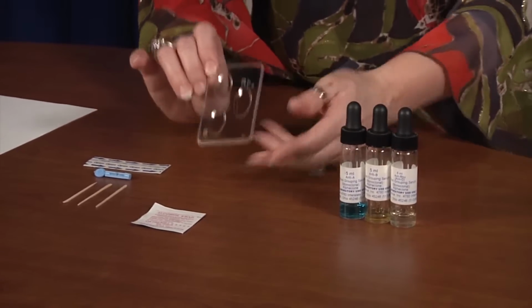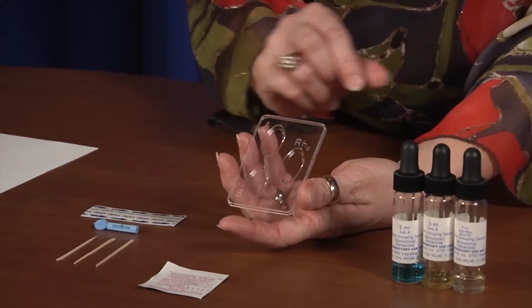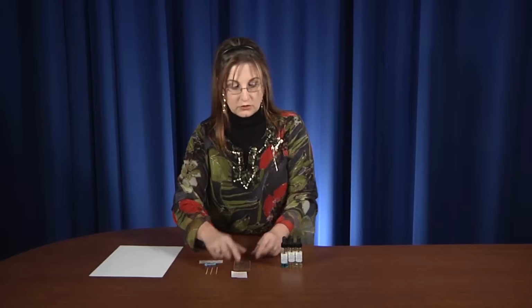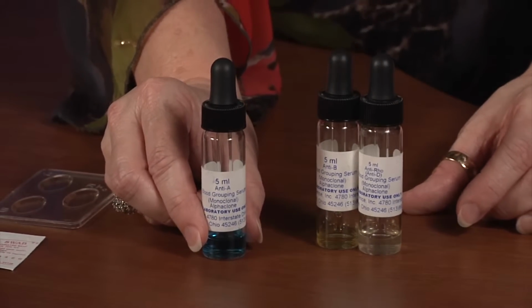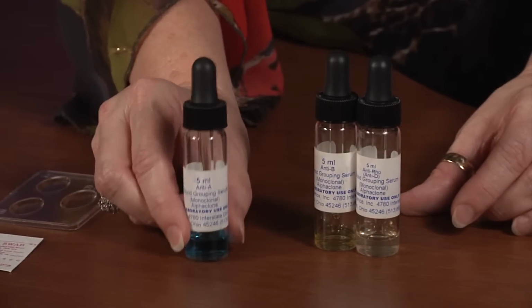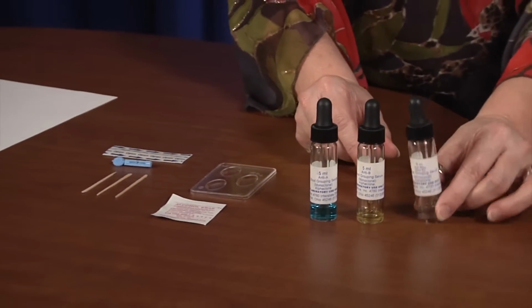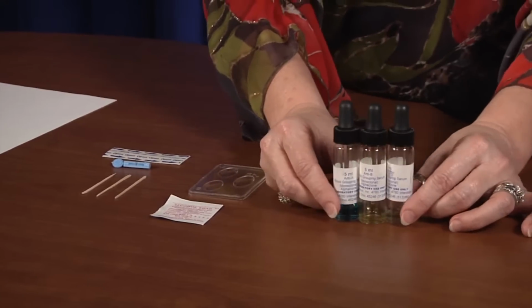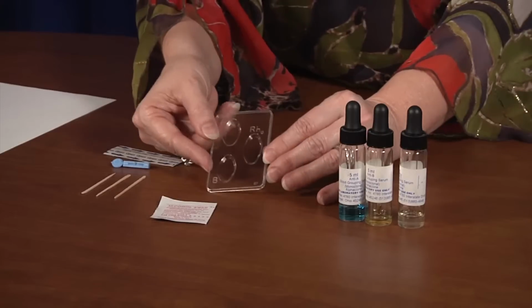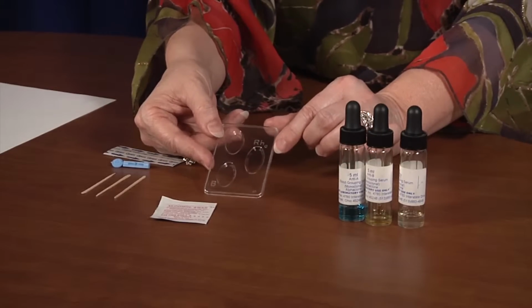Most of us will be using these trays that have 3 wells. The wells are marked A, B, and RH. That indicates what we will be putting into those wells. You're also going to need 3 bottles of sera. You have an anti-A serum, which contains A antibodies. You have an anti-B serum, which contains B antibodies, and an anti-RH serum, which contains RH antibodies. Those antibodies correspond with the wells on the tray. These letters on the tray indicate which of the sera you will put in.